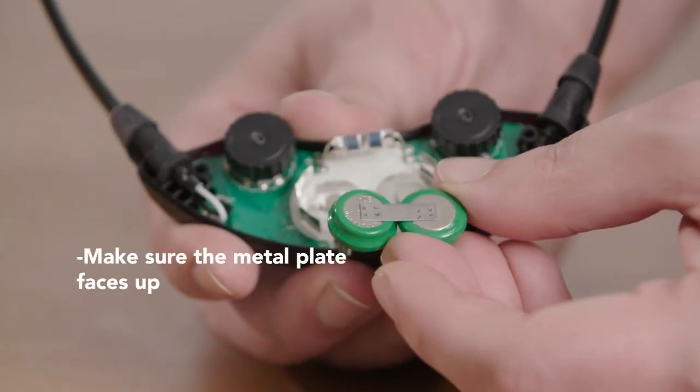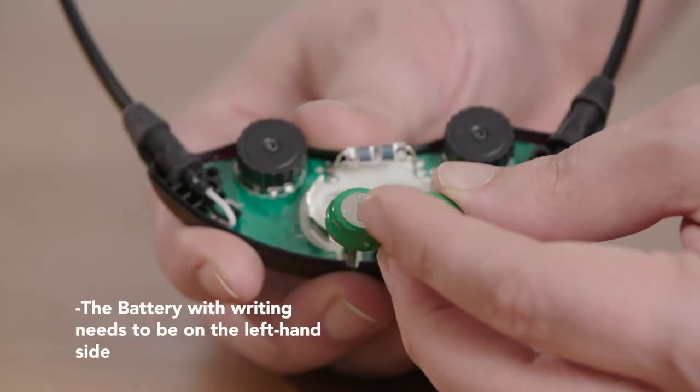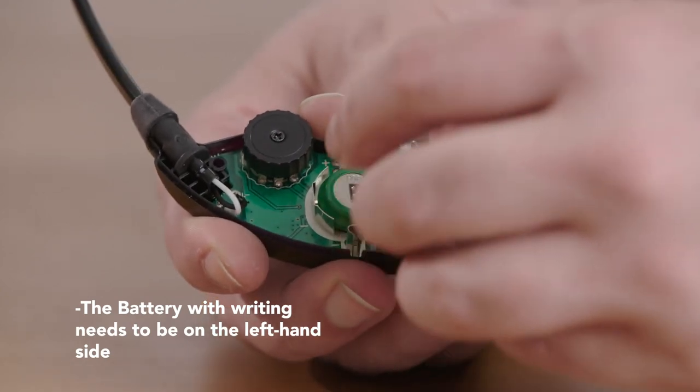The metal plate needs to be facing up towards us and the battery that has writing and a ring around it needs to be on the left hand side when we put it in.